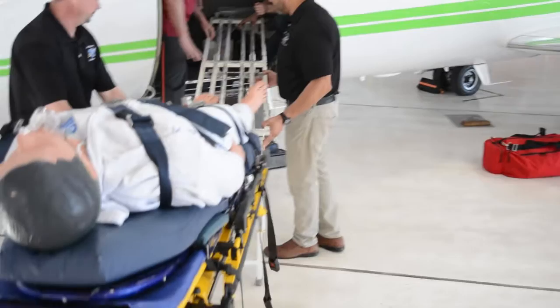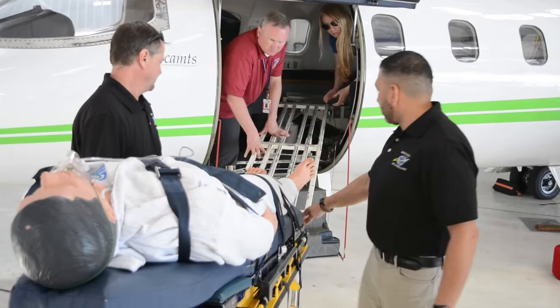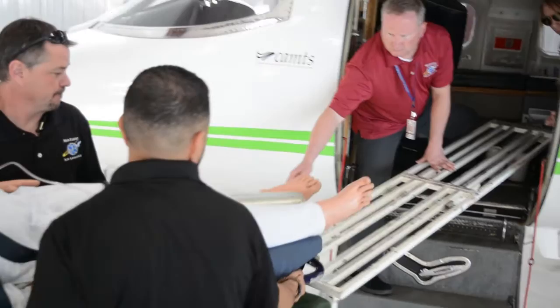We want to make sure that the gurney is lined up approximately at the same angle that the ramp is, and then we're going to communicate with each other. You can see that there's going to be a little bit of a lifting action to get past the lip of the ramp at the beginning, and then it's a matter of sliding the patient up along the ramp. Are we ready? 1, 2, 3. So we're on, and we're going to continue sliding the patient.